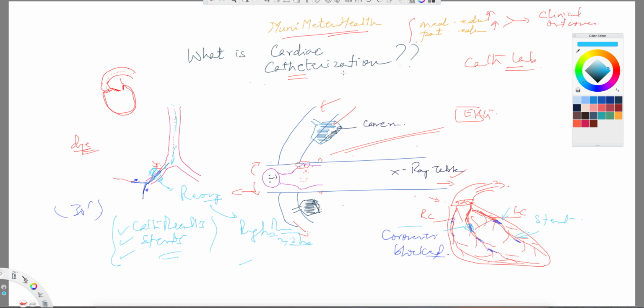Okay, so this was a quick short video. What is a cardiac cath? Why is it performed? And of course we know that it's performed because of coronary artery disease evaluation after a stress test that was positive, or when there is a suspicion of angina, or sometimes even during the acute MI, which is a heart attack setting, where they want to open up an artery and put a stent or balloon in there.